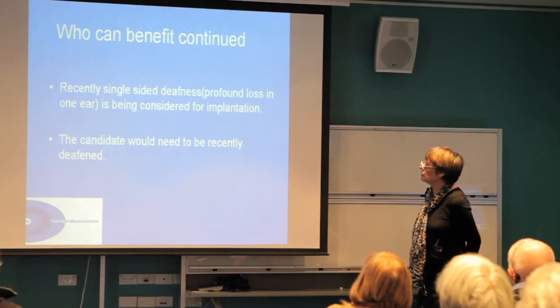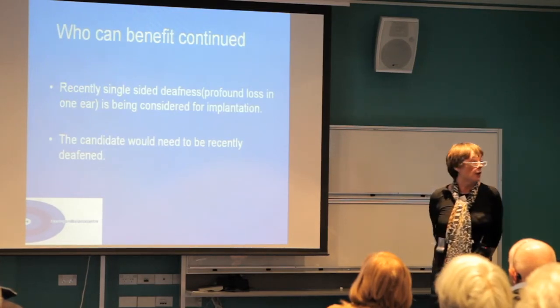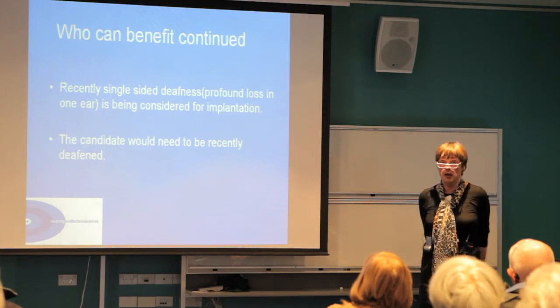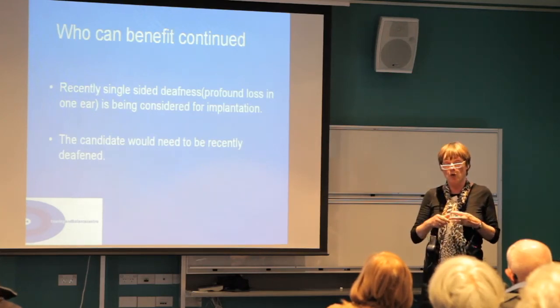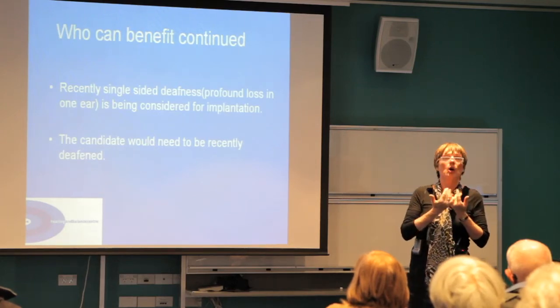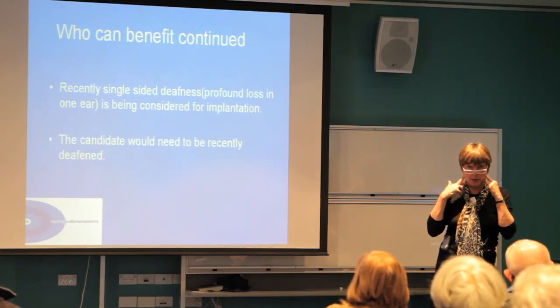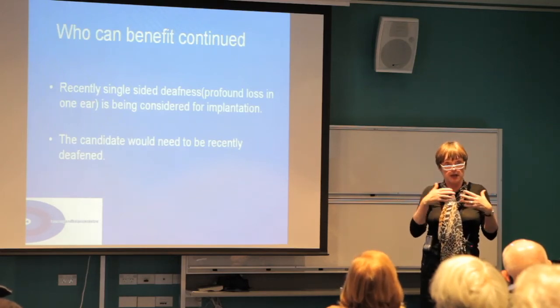So coming to the most controversial and recently changing criteria, and that is the use of cochlear implants with single-sided deafness, or what we would call a profound loss of hearing in one ear. Until recently, these people would have either worn nothing, perhaps tried a bone-anchored hearing aid, or a Cross hearing aid. There are a couple of options, without going into too much detail, which basically put a microphone on the deaf side and transfer the signal to the good side. So people are able to hear on their deaf side by using their good side. However, this does not give you back two ears. It just allows you to hear in that way.